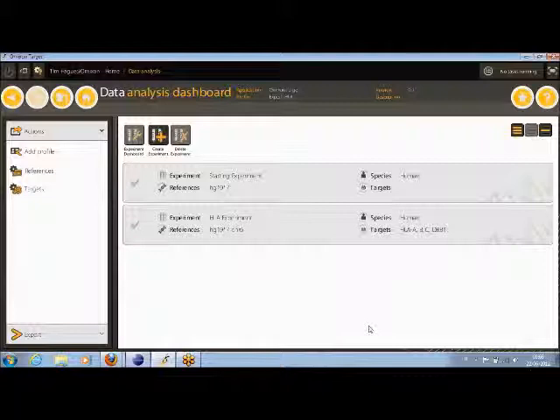So this half of the tool is more for general alignment of next generation sequencing short read data to reference sequences, and then we do a variant call and we can analyze the results in here, and we can start to filter the variants with various quality criteria to try and filter the list down to a more interesting and smaller list of candidate variants that may have some kind of diagnostic effect that we'll be interested in.